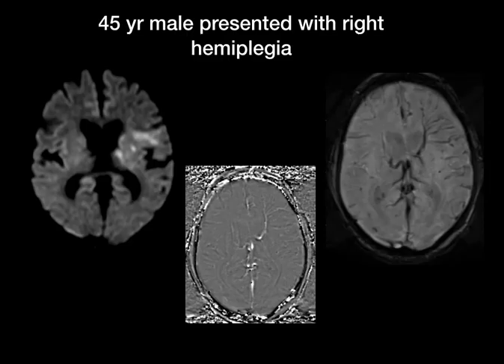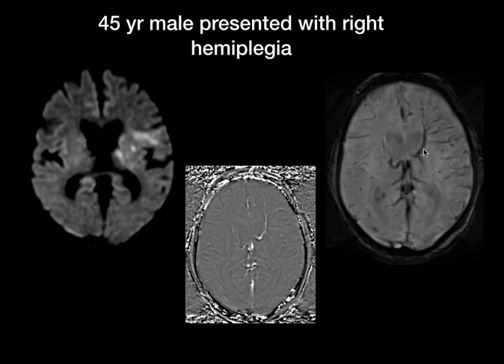A 45 year old male presents with right hemiplegia. Here it is obvious that there is a diffusion restriction in the left MCA territory, in the left capsular region and frontal lobe. These are the magnitude and phase images of susceptibility weighted imaging. Prominent veins are seen along with and even outside the area of restriction, as also depicted in the phase images.